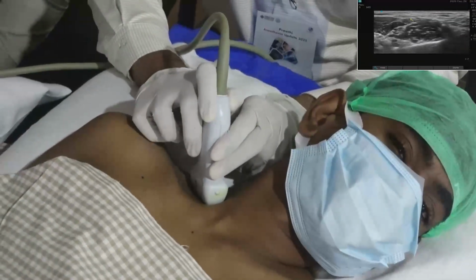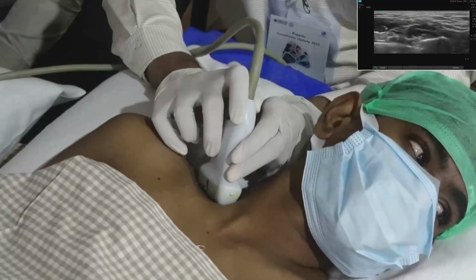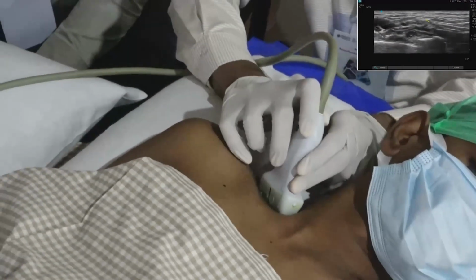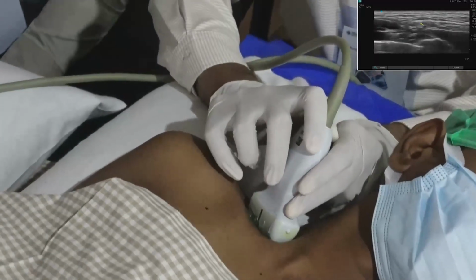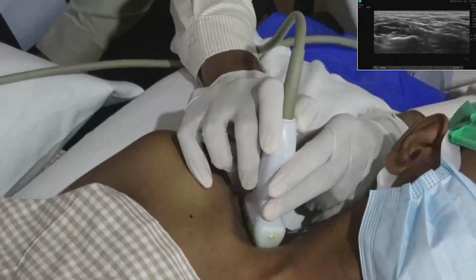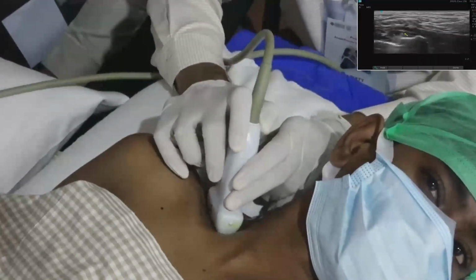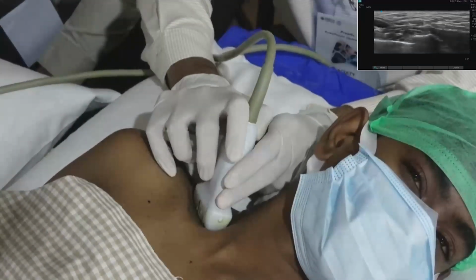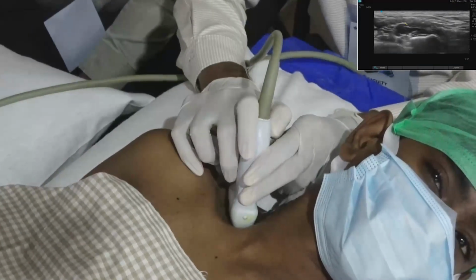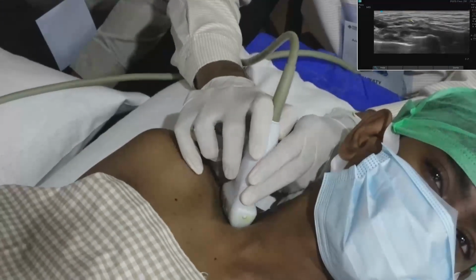Then we have to look for the suprascapular branch dividing. It is going below the omohyoid belly. Yes, so we can trace the suprascapular.